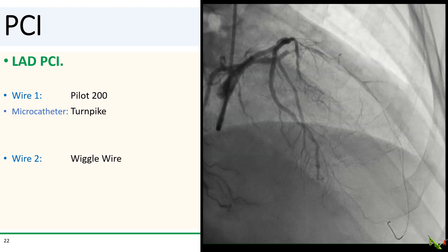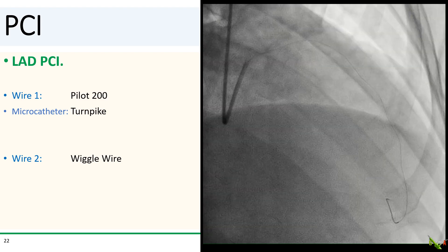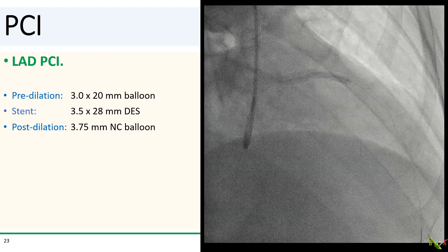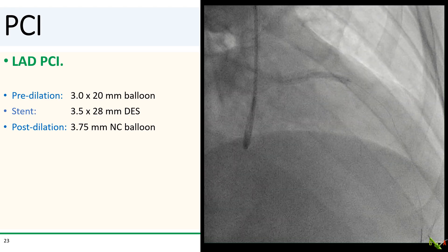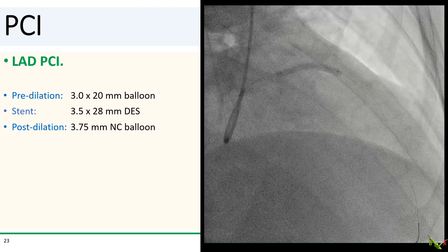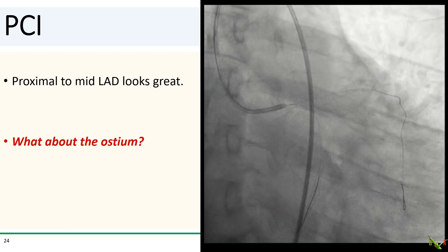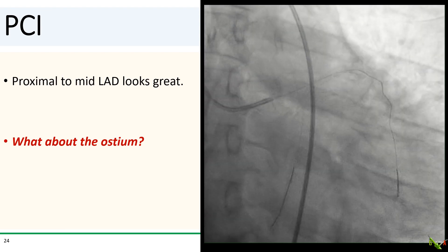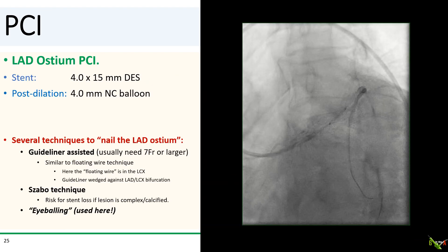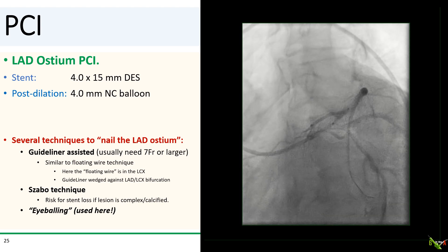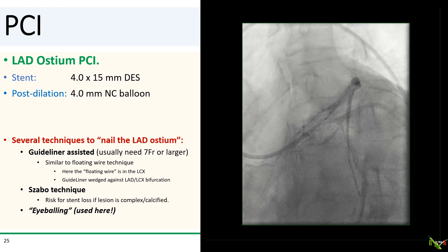We went ahead and gently wired the LAD with a Pilot 200 wire using a Turnpike microcatheter and exchanged the wire to a wiggle wire for better support. We then dilated the LAD with a 3.0 balloon, stented with a 3.5 by 28 mm DES, and post-dilated with a 3.75 balloon. After LAD PCI, the proximal to mid-LAD looks great, but we decided to fix the ostium as well — stenting with a 4.0 by 15 mm DES and post-dilating with a 4.0 NC balloon.